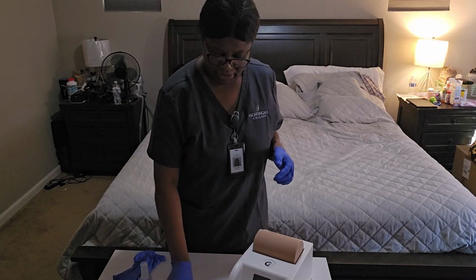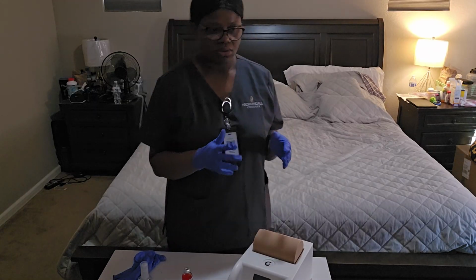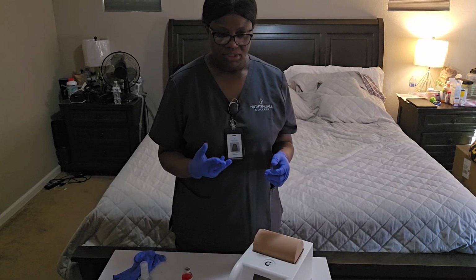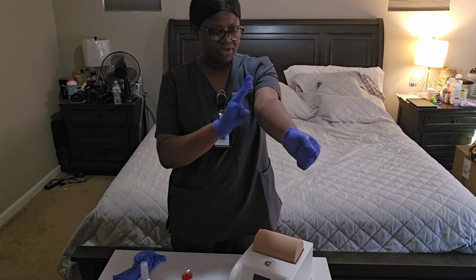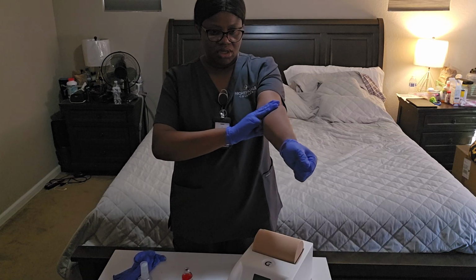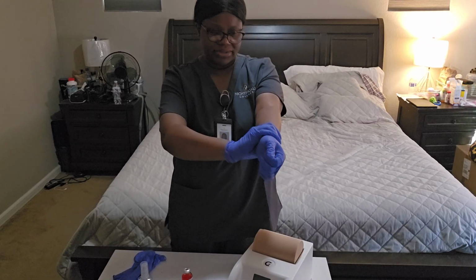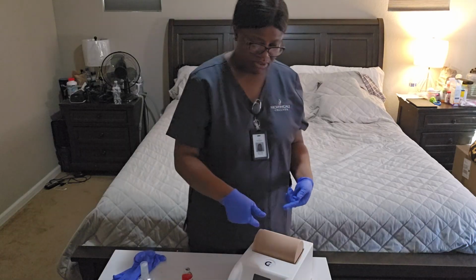So I'm going to keep this by the side. What next I'm going to do, I'm going to pick the site of the injection. When picking the site, I'm going to take out my 3 fingers, about 3 to 4 fingers below the antecubital space, or I would do like a hand width from the wrist. Okay, so this is the site of the injection that I'm going to be giving.